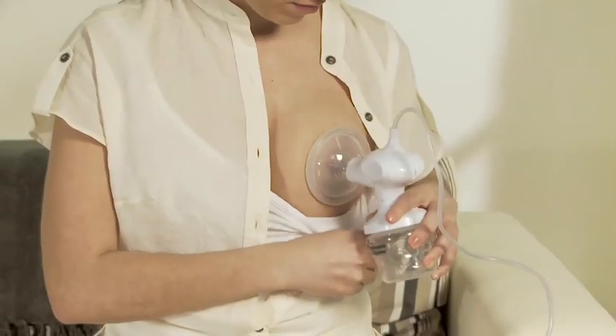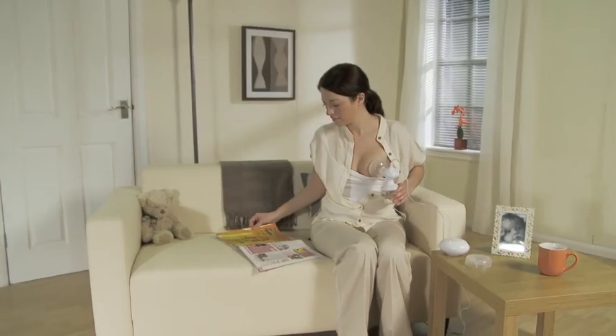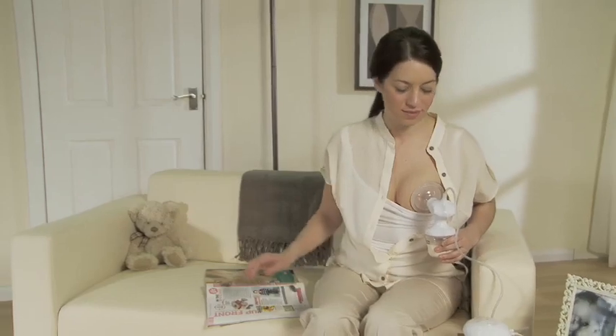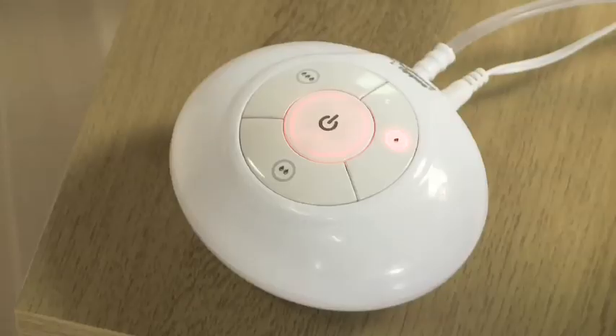After a few seconds your milk should begin to let down. Within a minute or so your milk will start to flow. This means you're ready to switch to the low expression level on your electric breast pump. From there, progress to the medium or high setting as required. If a particular setting proves uncomfortable, you can always go back down the scale.